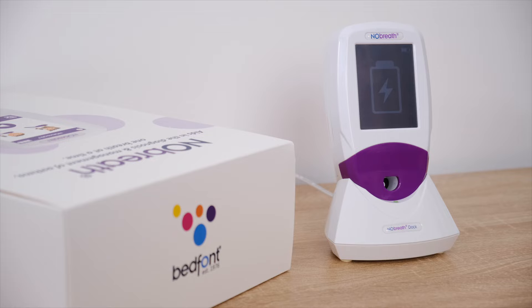In Chapter 2, we will cover how to set up your device, including charging the No-Breath Pheno monitor and how to clean the device.